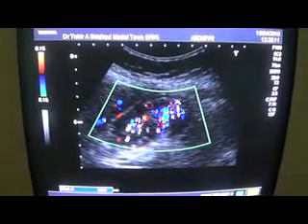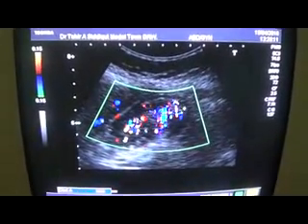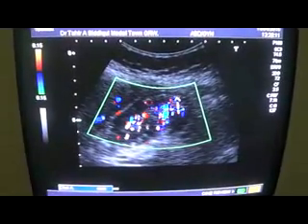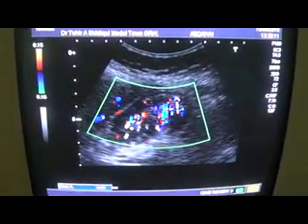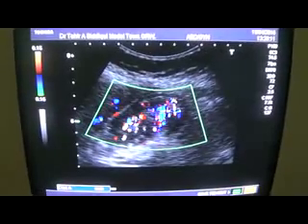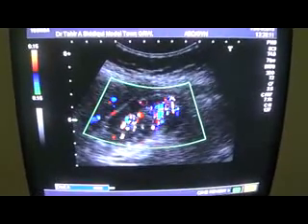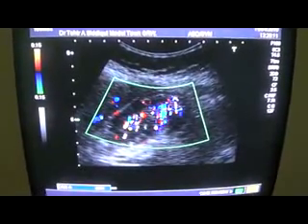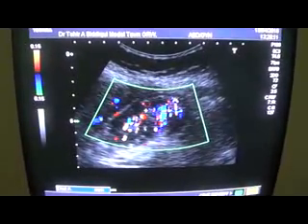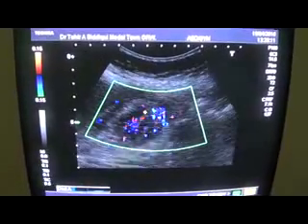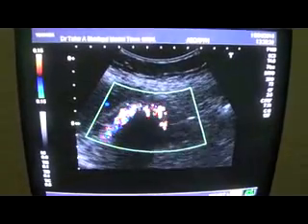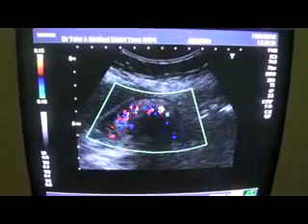This shadowing is called in the language of Doppler as twinkle artifacts. These twinkle artifacts are all originating from the numerous calcoli that we are seeing within the lumen of the gallbladder.